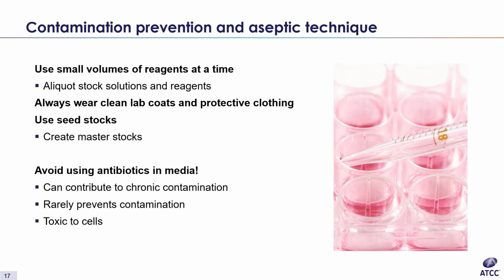There are a few reasons in addition to the potential of toxicity. If you use media with no antibiotics, and a contaminant enters your cell culture, chances are it will be visible within a couple of days. You can then discard the infected dishes. However, if there are antibiotics present, it may slow the growth of the contaminant, allowing further passages and freezing down of your cell lines. In short, you may be saving large amounts of contaminated cells that can cause problems down the road.